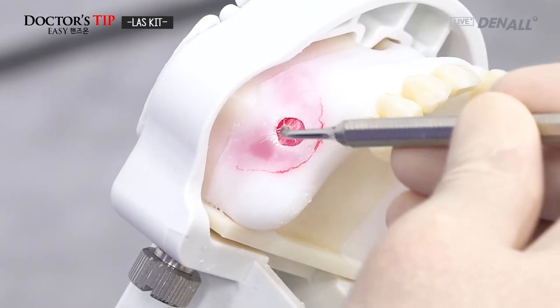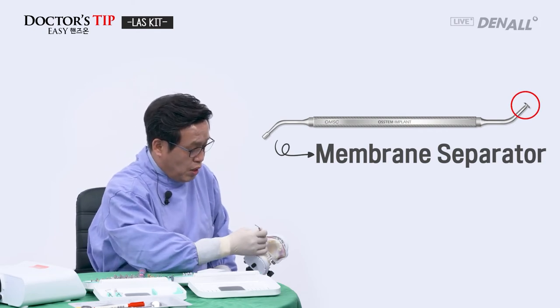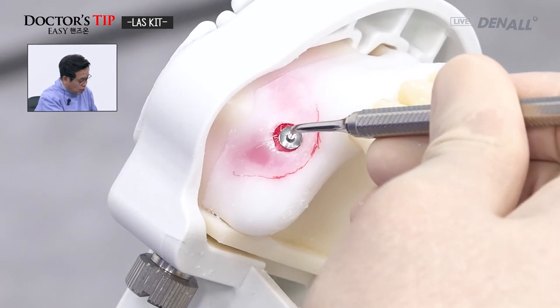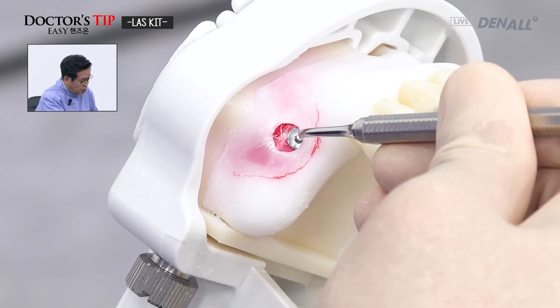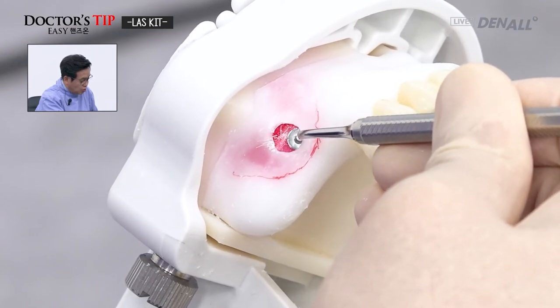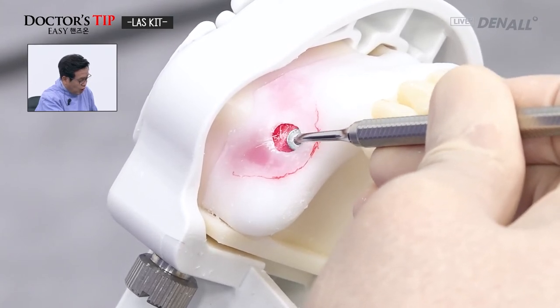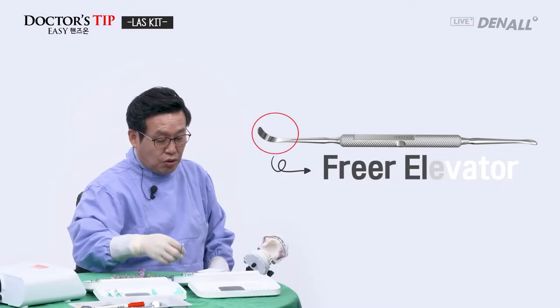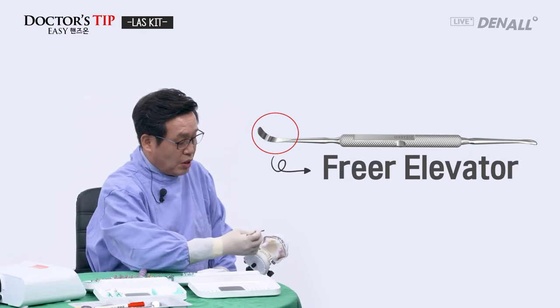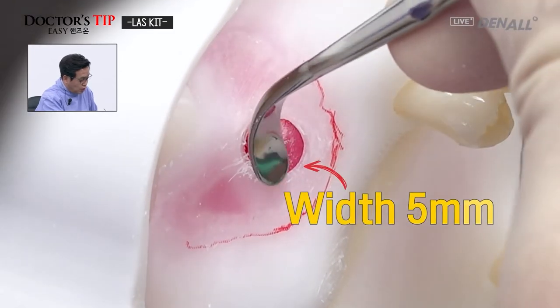So with the wide dome drill, we do the widening, and then of the sinus instruments, first for the initial detachment, the rounded part can be used. Then between the sinus lateral window, membrane and bone, initial detachment can be done. So without hurting the membrane, you can detach the membrane very easily. Now, personally, I use the freer elevator part. So the width is 5mm here.